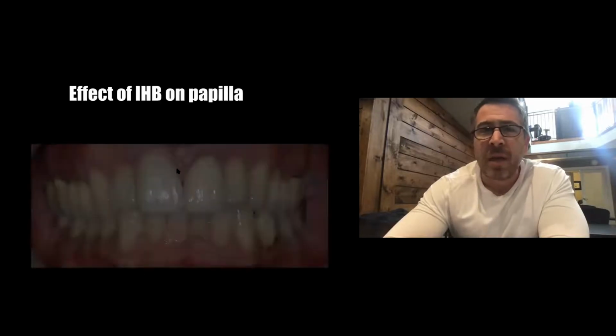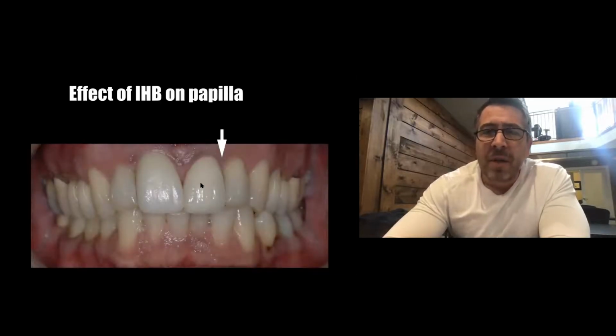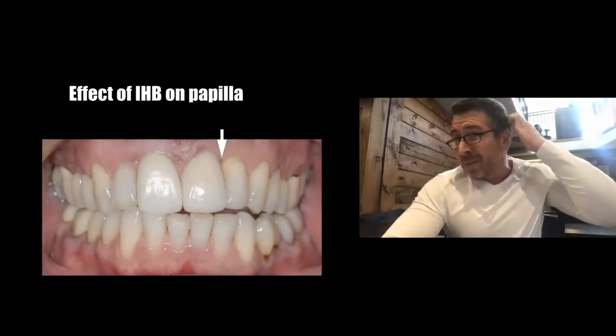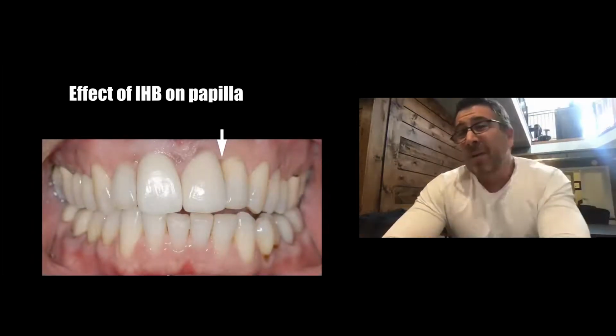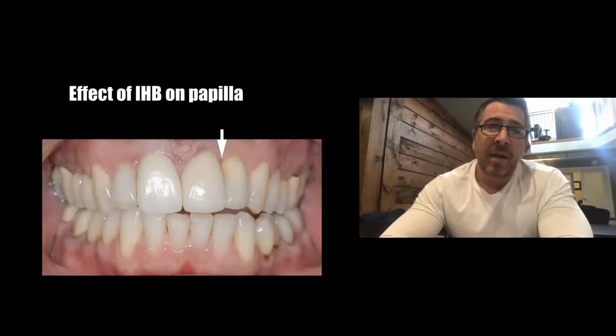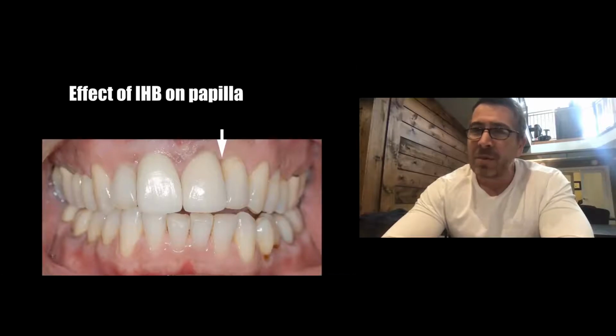So there's the final implant. We've moved the implant away from the adjacent tooth for a nicer emergence. And watch what happens. So here's the implant on the 1-1. There's a crown on the 2-1. The tooth is removed. He has a papilla. I extract the tooth, I place the implant, and what happens? The papilla got lost. And quite frankly, I predicted that by looking at that film pre-treatment, looking at that root proximity, and being able to anticipate that he has a risk of losing 1 millimeter or so of bone and maybe losing some papilla. Is that an issue for your patient? I don't know.